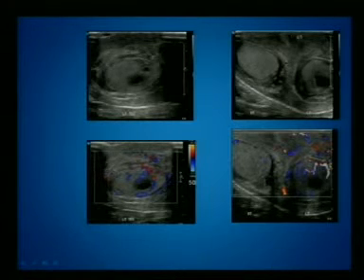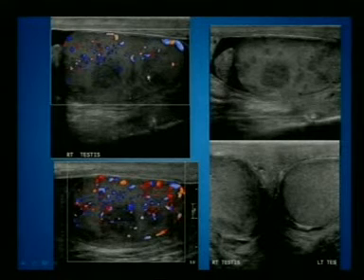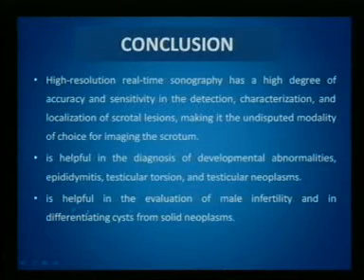You have seen the skin thickened with hyperemic scrotal skin and increased vascularity of the testis, and an anechoic area surrounded by hypervascularity, with abscess. Another patient, 5 minutes, Dr. Hisham. Almost finished. Another patient with increased vascularity with hypoechoic areas in the testis with abscess formation.